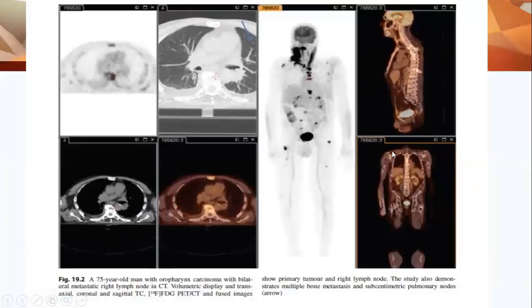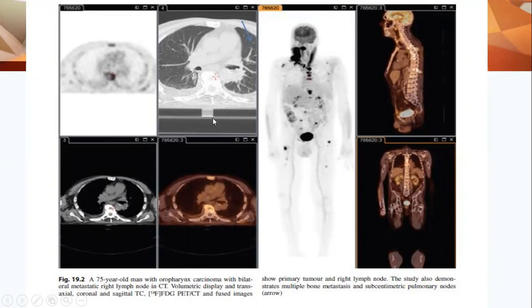Another case: a 75-year-old man with oropharyngeal carcinoma and bilateral cervical metastasis, especially on the right side, with multiple metastases in the bone, lungs, and abdomen. There is also a focus of a lung nodule in the left upper lobe.